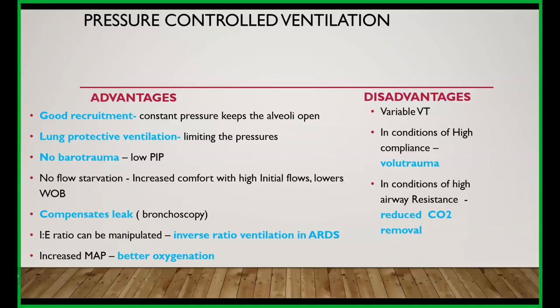Then it also compensates for the leak, because when the leak increases, the pressures will naturally tend to increase, which compensates for the leak. Your volume is going to increase according to the leak. So in a leak, there will be a drop in the pressure, and in order to keep the constant pressure, your volume is going to increase naturally. So the leak is compensated.